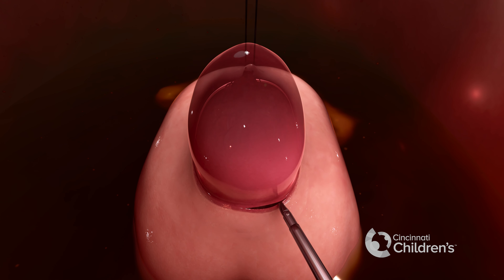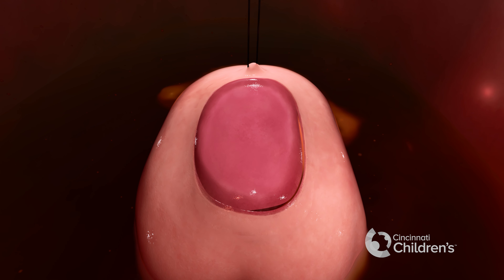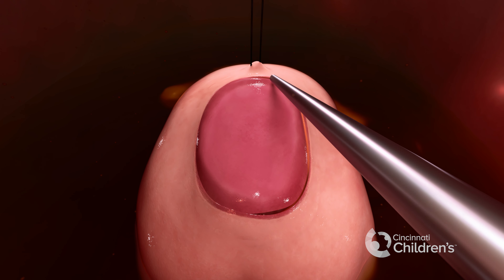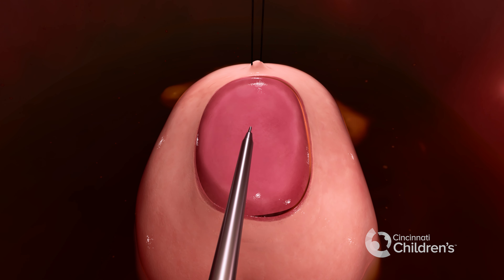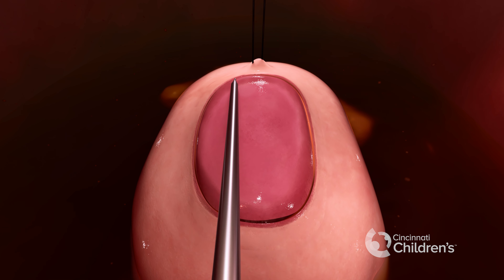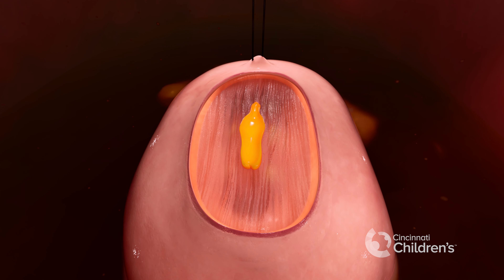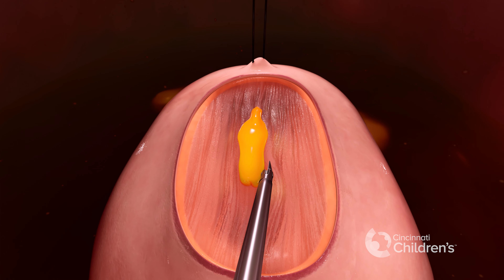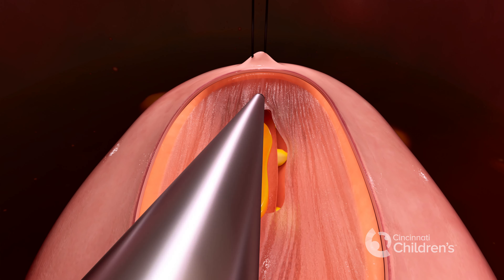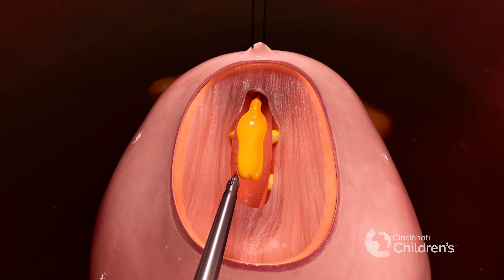We first open up the sac all the way around the spina bifida defect. Once the sac is completely open, we free the placode, or exposed portion of the spinal cord, from the surrounding tissue. This procedure, which is called untethering, allows the placode to fall back down nicely into the spinal canal.